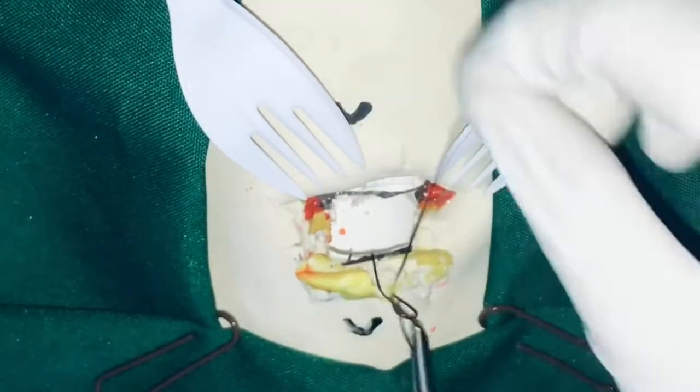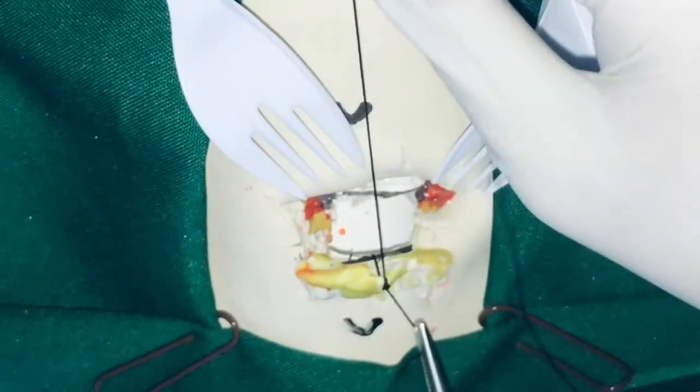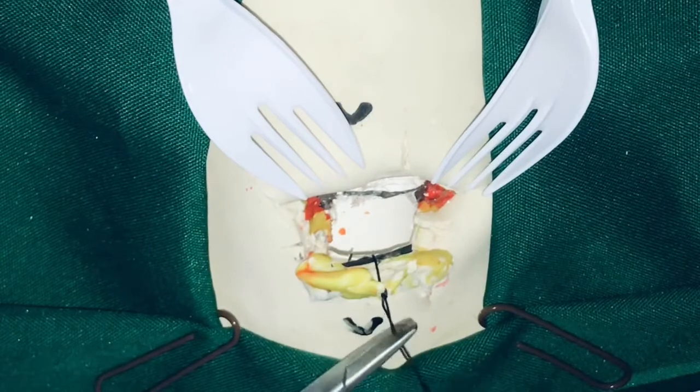It is important to communicate with the anesthesia provider again at this point to deflate the cuff, pull the ET tube back until the tip is in view.